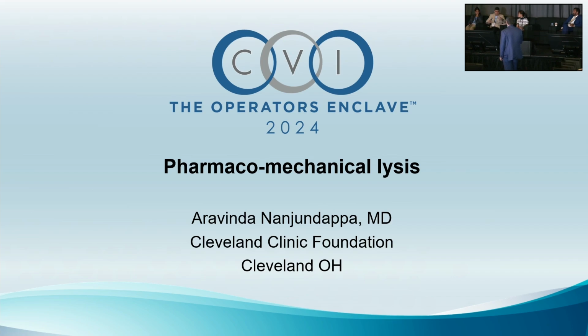There's not even numbness, there's nothing. So I think this is a case where we have time, especially since the location of the thrombus was very dangerous in the CFA, so you know you're going to get in trouble if you come across it with any type of device. So I think this case would have been a perfect case for lysis for 12, 18 hours, bring them next day to the cath lab and deal with it, and it's very acute, so I think we'd have taken care of it.